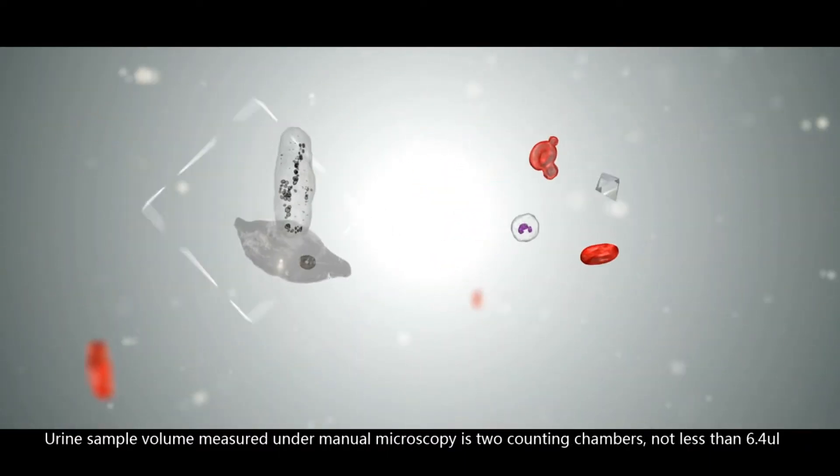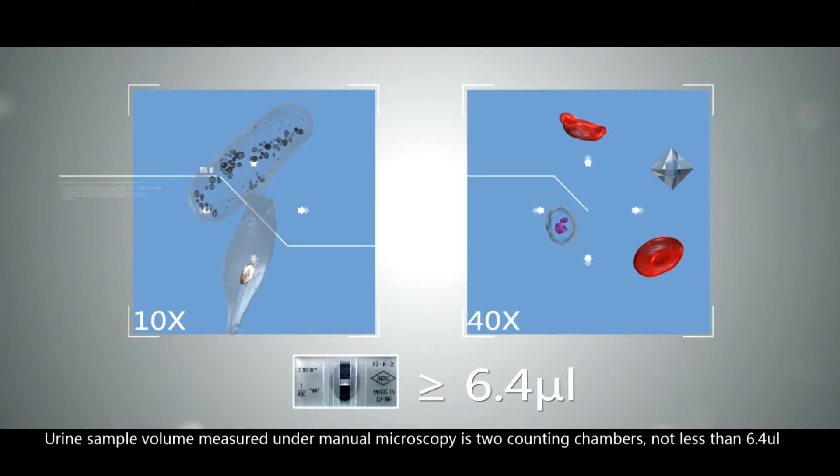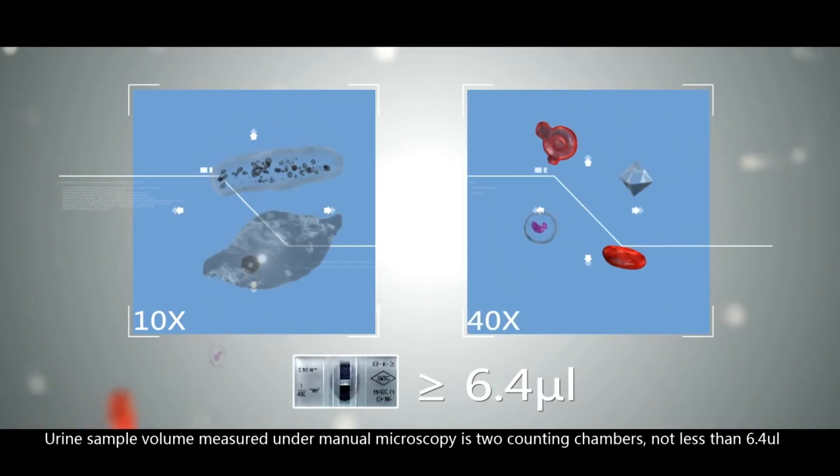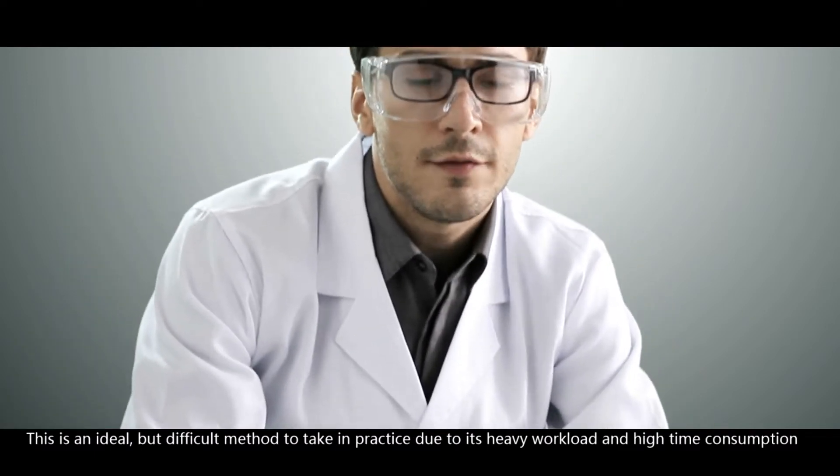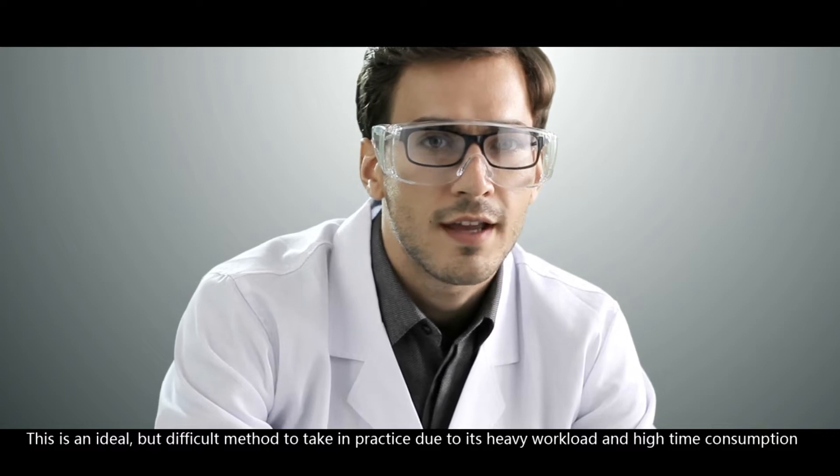The urine sample volume measured under manual microscopy is two counting chambers, not less than 6.4 microliters. This is an ideal but difficult method to take in practice due to its heavy workload and high time consumption.